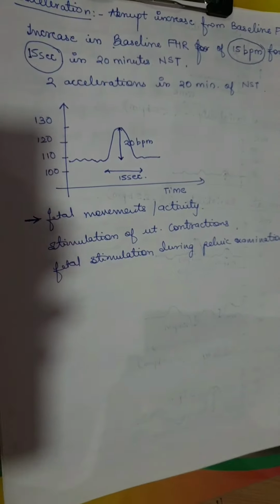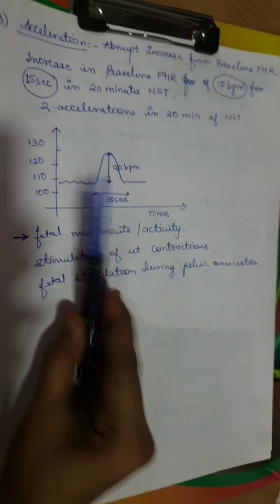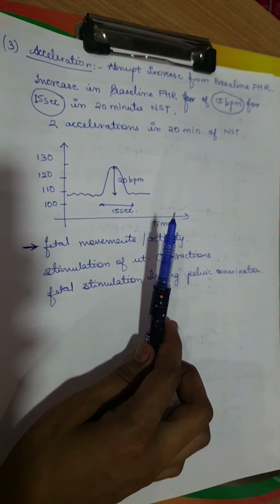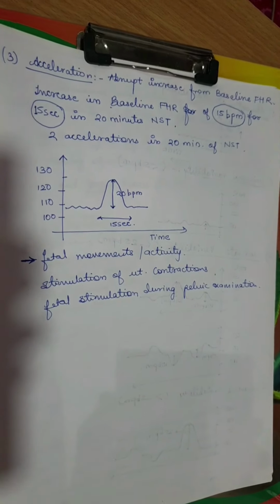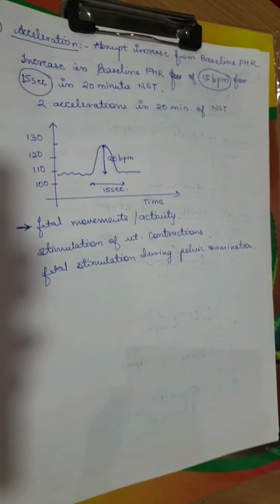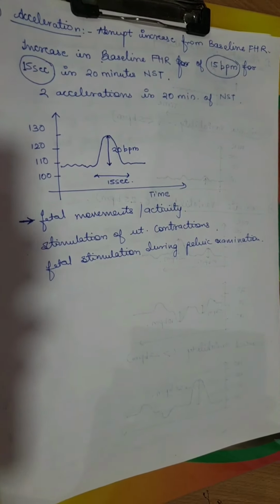So in 20 minutes of NST, if we do not find such accelerations, but there is the presence of baseline variability, the absence of acceleration does not signify that the fetus is compromised or the environment is unfavorable for the fetus. Now, are the accelerations good or bad? Yes, they are a 100% good sign, and they also signify a healthy fetus which has proper fetal movements and proper breathing movements.